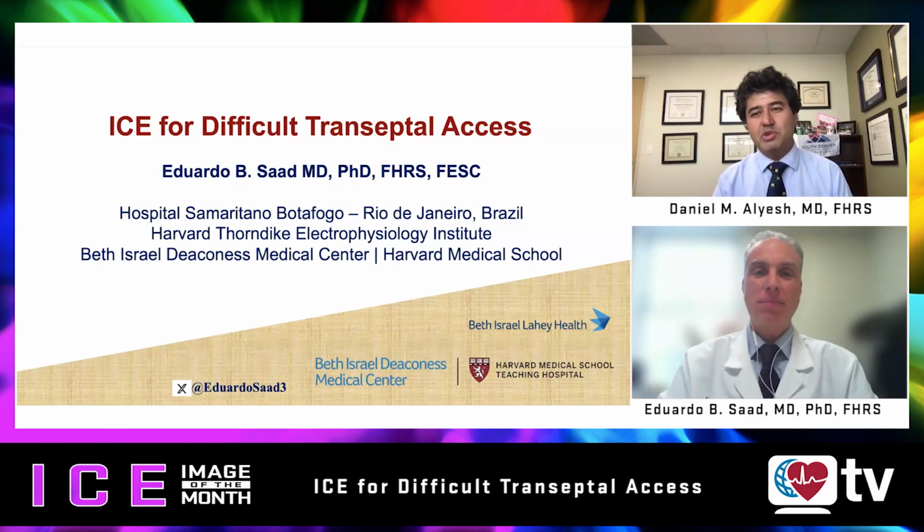So, transseptal access, we do it all the time. When it goes great, great. But there are a number of difficult situations with transseptal puncture. So we hope to have this episode be a resource, not only locally but globally, for understanding ICE and broadening its usage for difficult transseptal punctures.